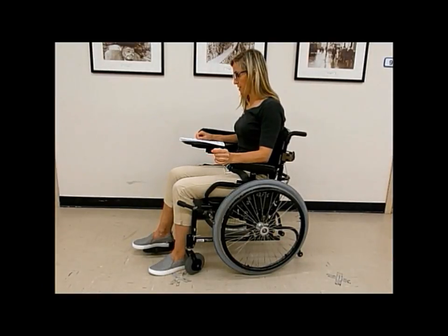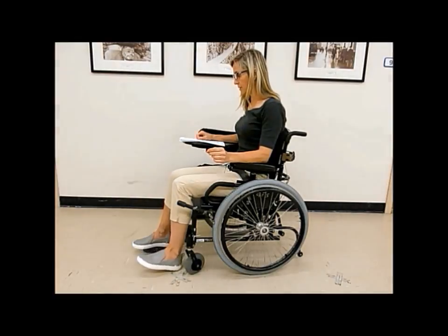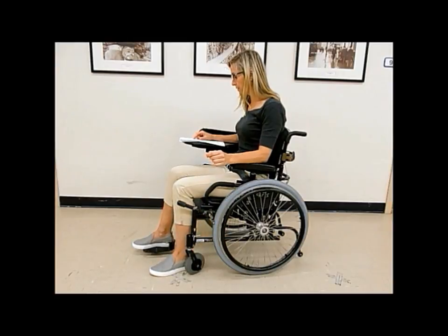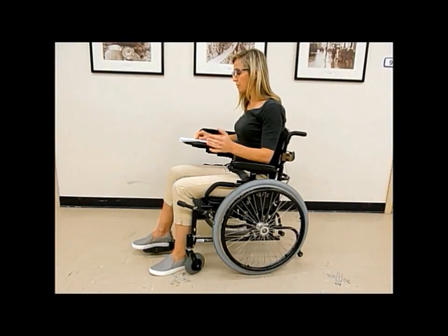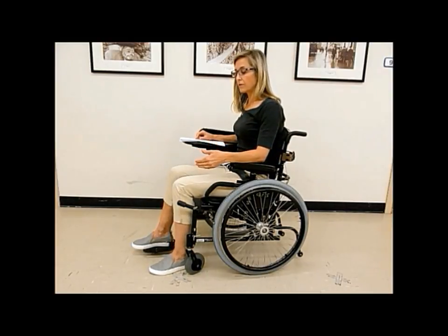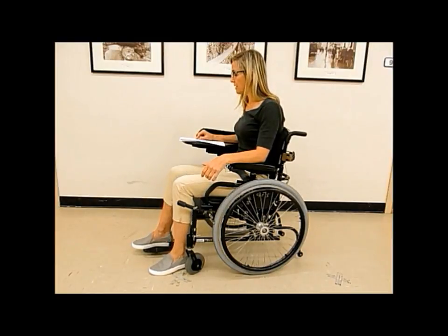When setting up a wheelchair for hemi-propelling, you need to balance the needs of seating with the needs for efficient propulsion. Sometimes the seating needs will conflict with the mobility needs, and this is when you have to use your clinical reasoning to determine the optimal setup for your client. So complete your MAT assessment, your measurements and your goals as you would for any other client to establish the seating objectives, and then consider the mobility needs for hemi-propulsion.